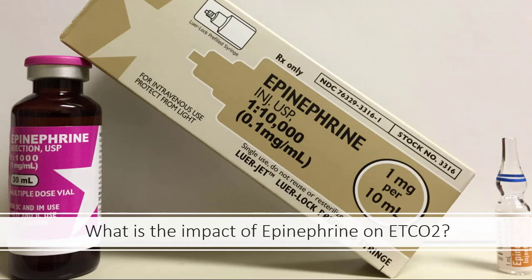So the question is why? This was done during chest compressions and occurred within 1 minute of administration of epinephrine, so we're pretty sure there's a strong association. It affected coronary perfusion pressure significantly, but for some reason end-tidal CO2 dropped.